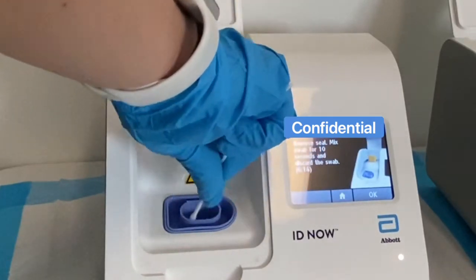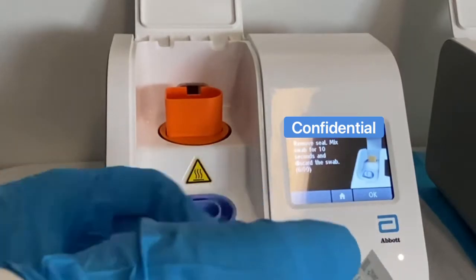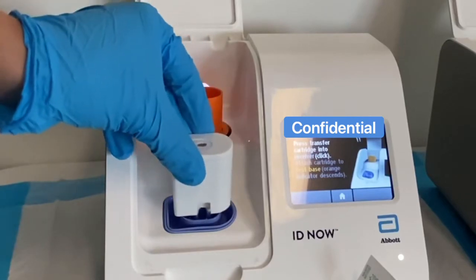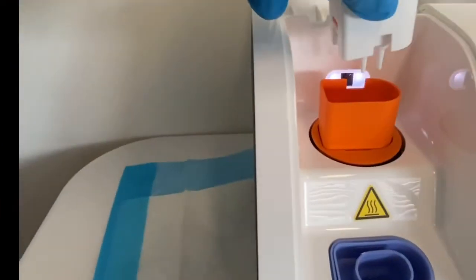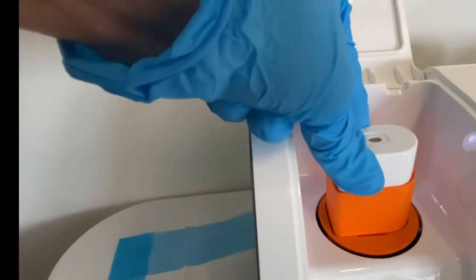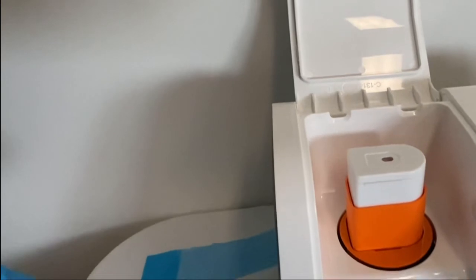As you can see in the parentheses on the screen, there is a timer. You have to make sure that you do the 10-second swab within that time limit. Afterwards, press the OK button. It will then tell you to press and transfer the cartridge. Click once and the little orange piece will pop up, then transfer the sample over to the base. From there, hit two clicks, the little orange piece in the middle will go down, and that's when you know you're good to go.